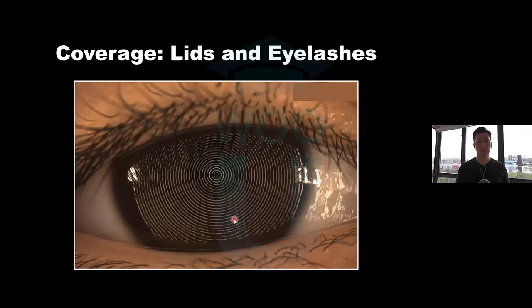As an example, we want to understand the kind of toricity this lens needs. And with this topography, I've got lids blocking a good 30% of the superior cornea, maybe 10% of the inferior cornea. I've got eyelash shadows coming down. So I've got to find a way to get this patient to open up.